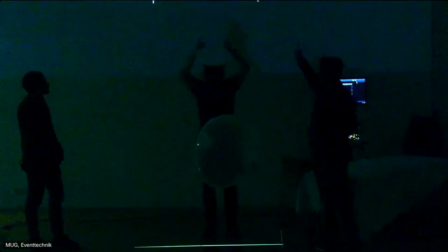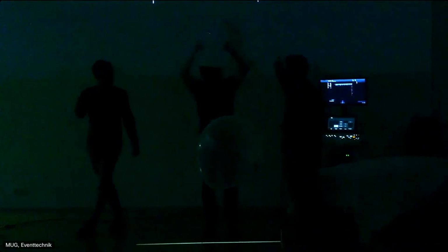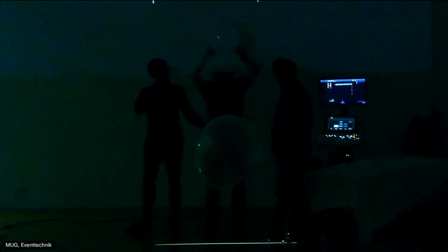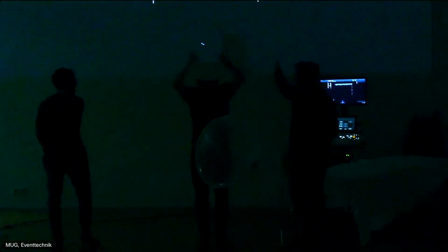So please start with a sliding movement out of plane. Just one step forward. The sliding movement out of plane, so you go just a little bit forward in this case. Another step. Okay, stop here. Great, stop. Yeah, okay, so with my whole body.